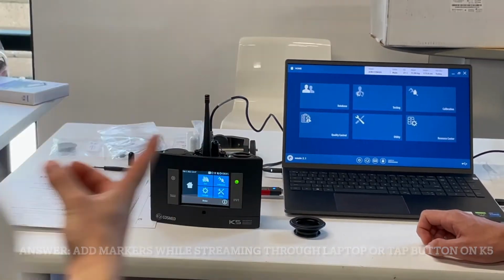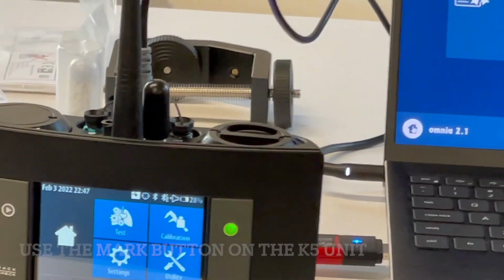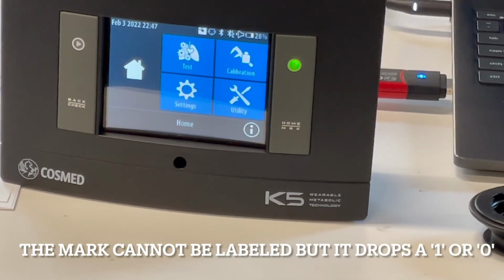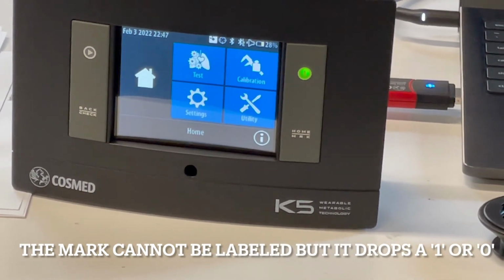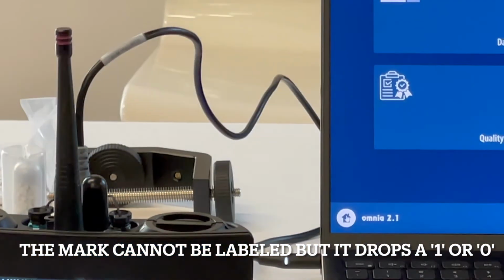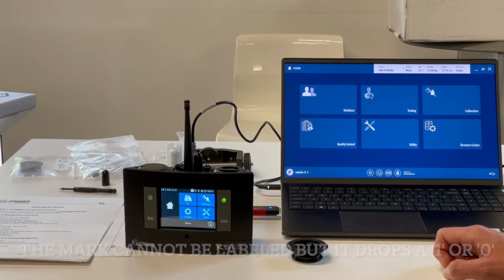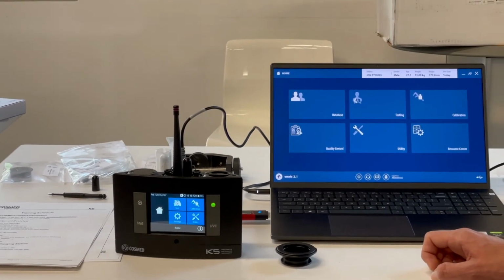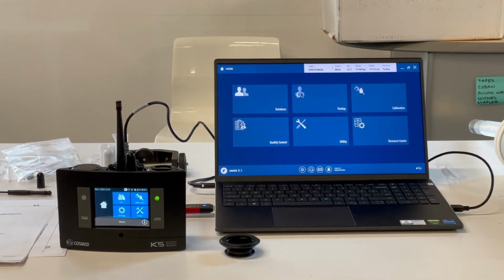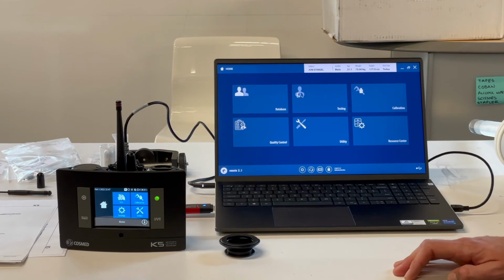You click it once, and then the next time they take a breath, it'll pop up with a little yellow text, and it says marker. You have to be careful. It just puts a 1 or a 0 in the one text column with each breath samples. So when I'm doing mine, I do one start, one stop. I always hit it unless I have to restart a condition, and then I'll delete it.